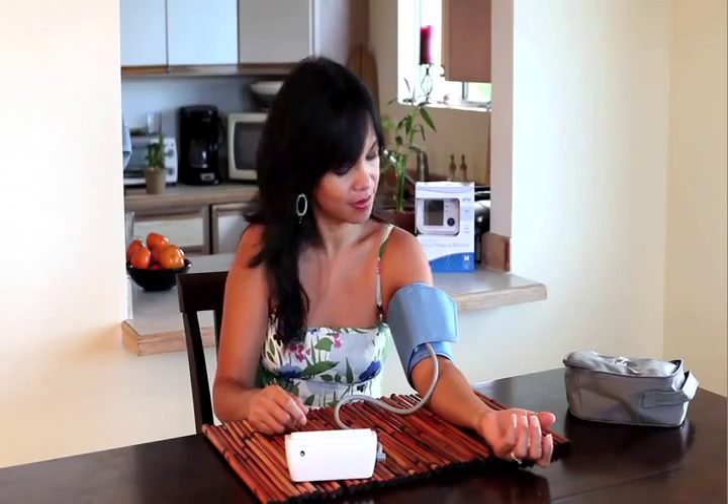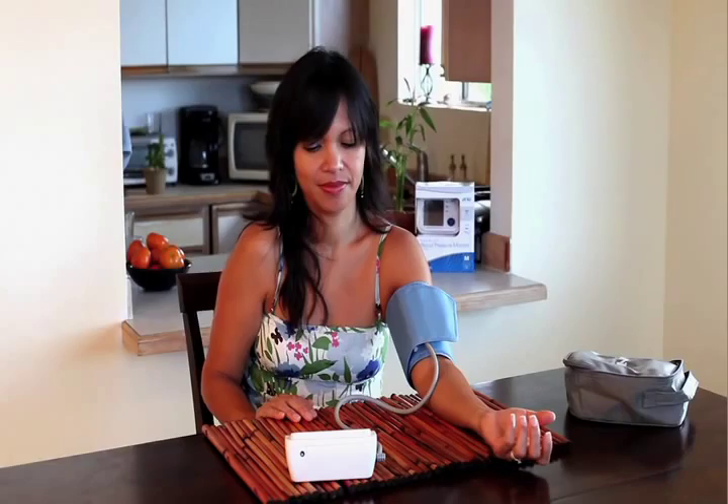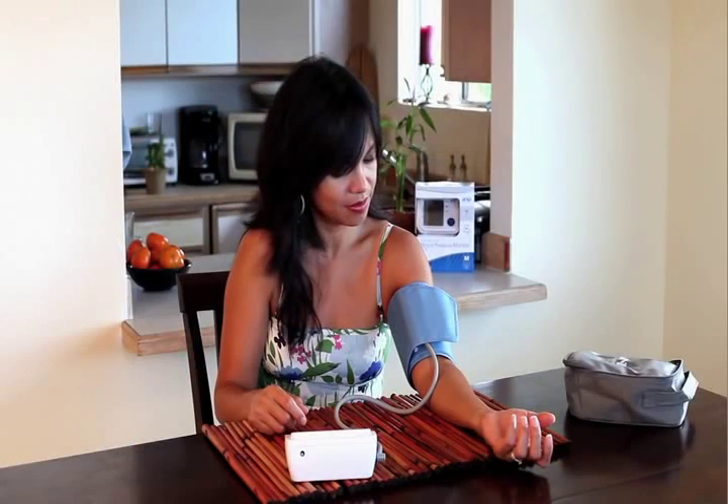Preparing to take measurements — please do not talk or move. In a few moments, your blood pressure will be clearly visible on the large, simple-to-read display. And the Talking Monitor will tell you the results as well.